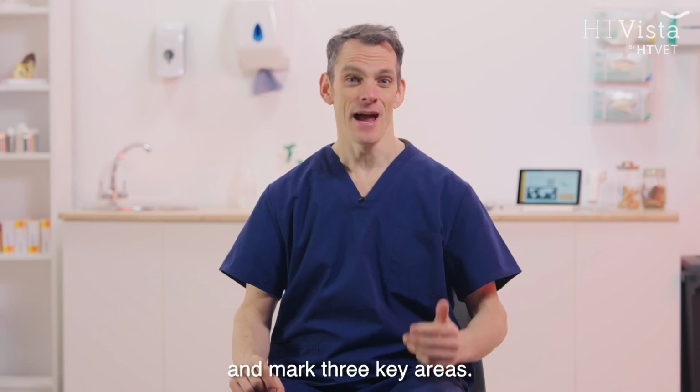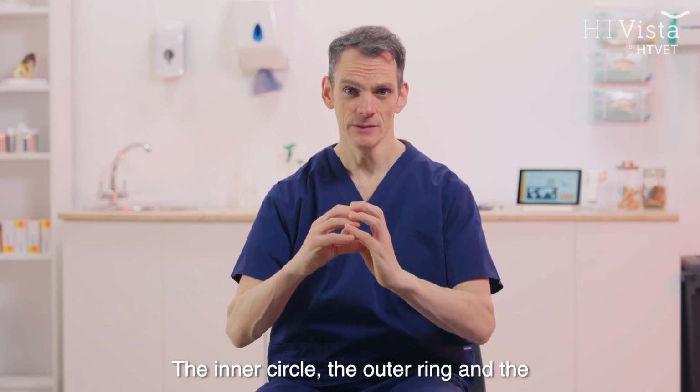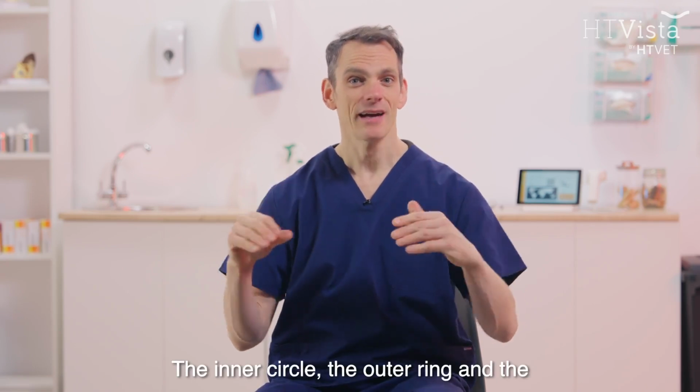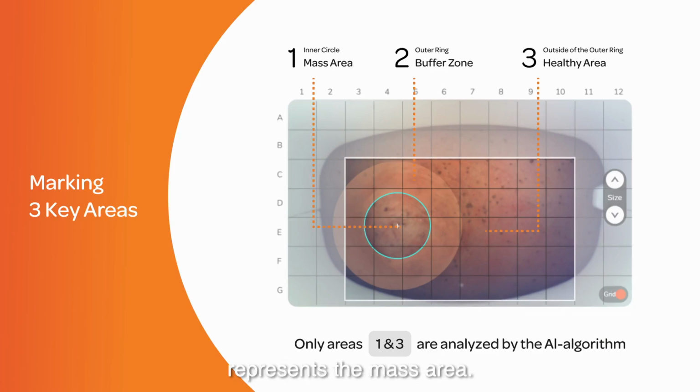You need to identify and mark 3 key areas: the inner circle, the outer ring, and the area outside the outer ring. The inner circle represents the mass area. The outer ring acts as a buffer zone and separates between the mass area and the healthy area. The area outside of the outer ring represents the healthy area. Only areas 1 and 3 are analysed by the AI algorithm.